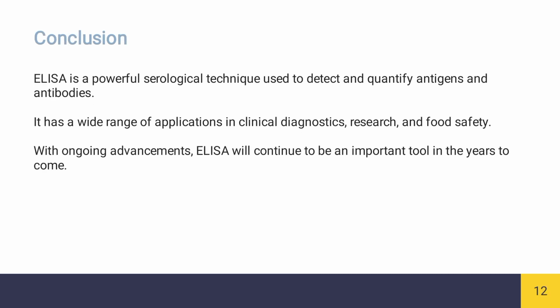Conclusion. ELISA is a powerful serological technique which is used to detect and quantify antigens and antibodies. It has a wide range of applications in clinical diagnostics, research, and food safety. With ongoing advancements, ELISA will continue to be an important tool in the years to come.